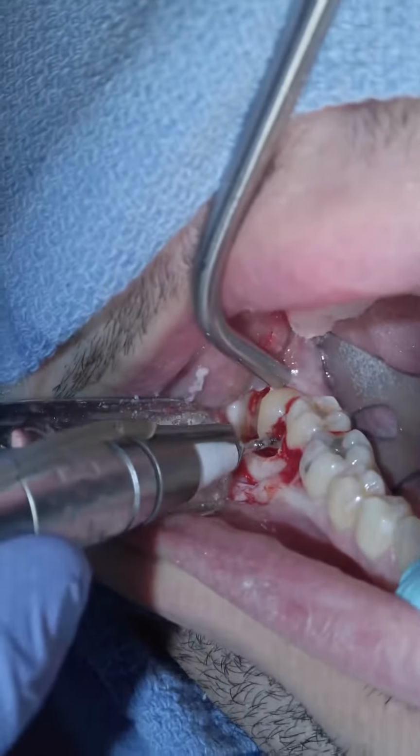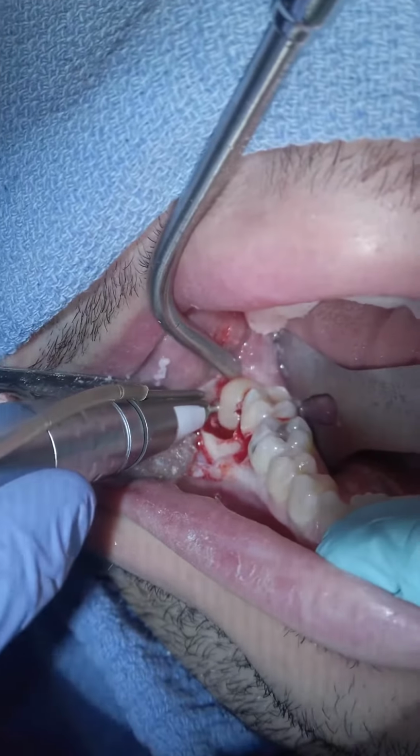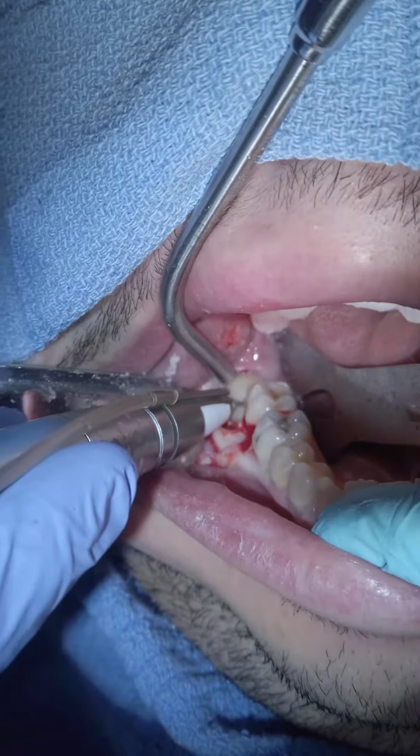Now this crown, we can maybe squeeze it out of there, but we're not going to do that because we didn't talk about that ahead of time. So we're going to do another section right here. Boom. Right down the middle.